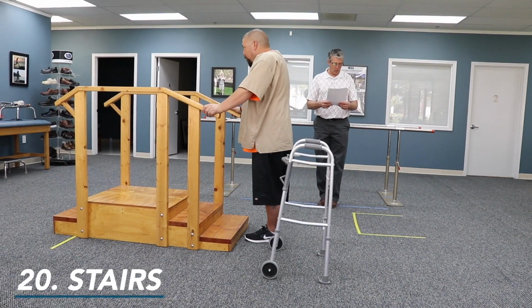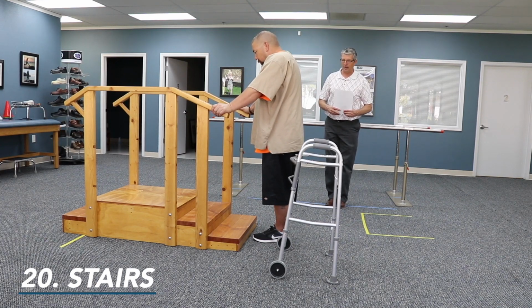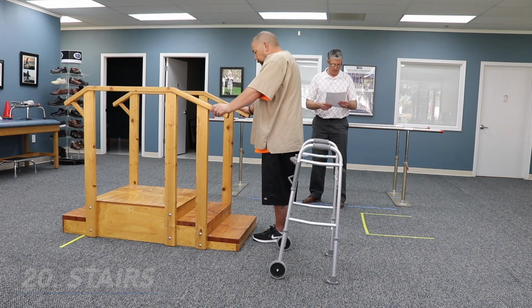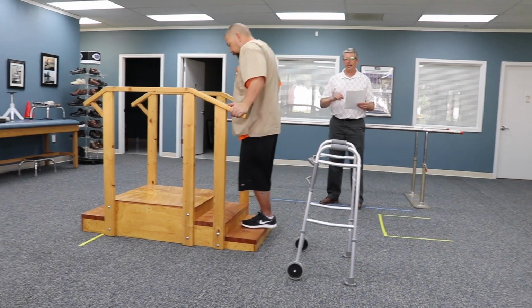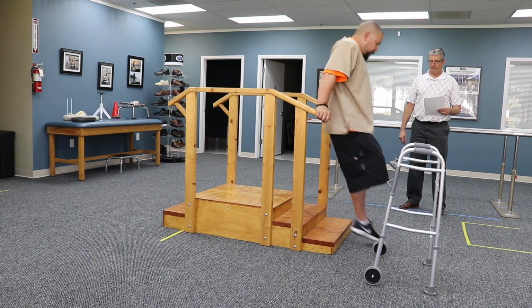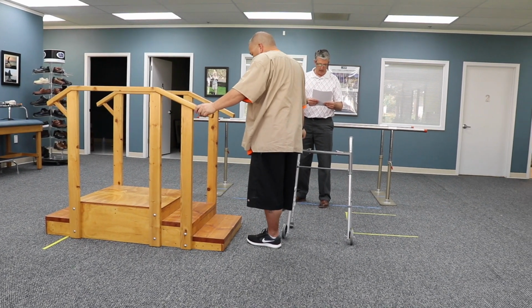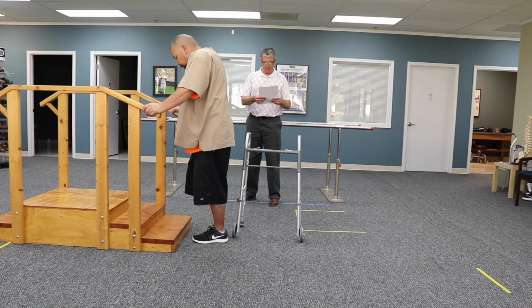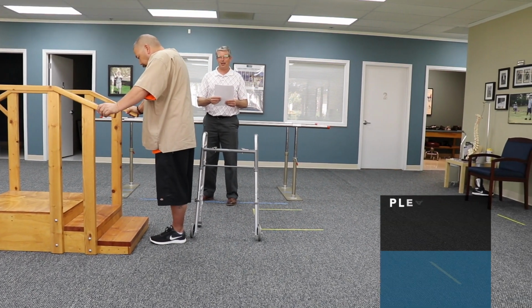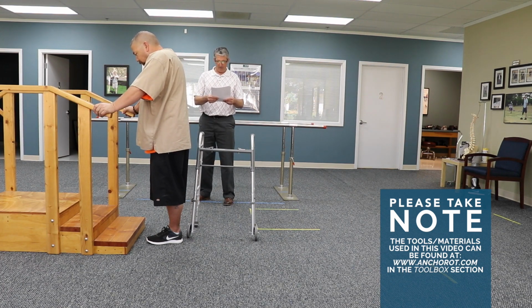Okay, this is number 20, stairs. So you can have your patient come to the stairs. Now this is Jay without his prosthesis on. He's going to go ahead and go up and down the stairs. You're looking at ascending and descending independently. Okay, so he was able to ascend in a controlled manner, step over step, kind of. Without his prosthesis, you can't assess that. So since he wasn't able to do that, and he must use the railings for support, he got a 1 on that, both ascending and descending.